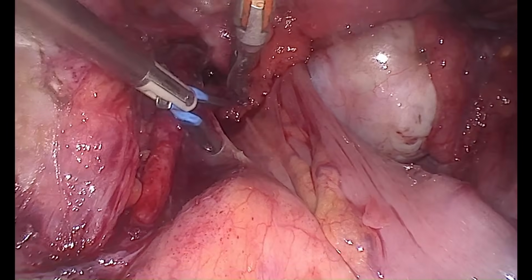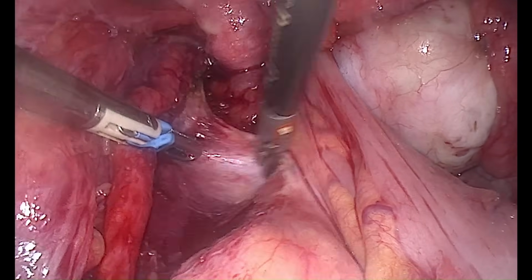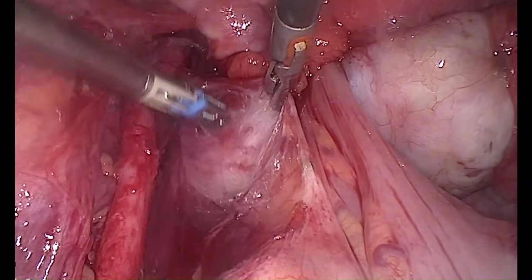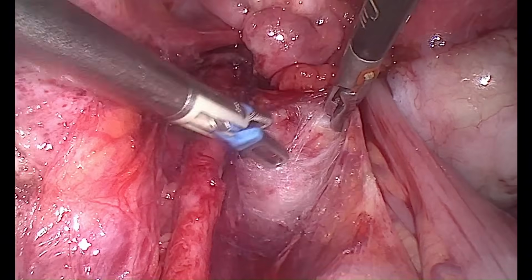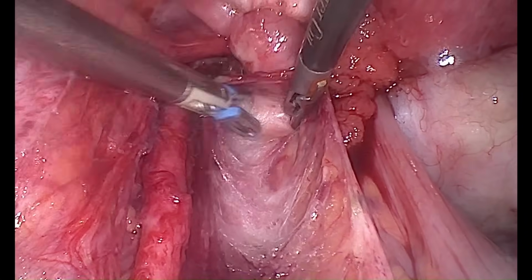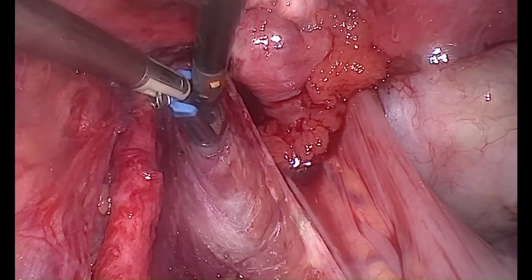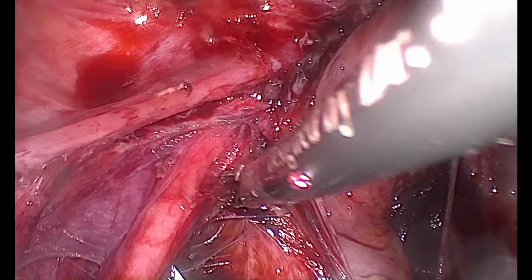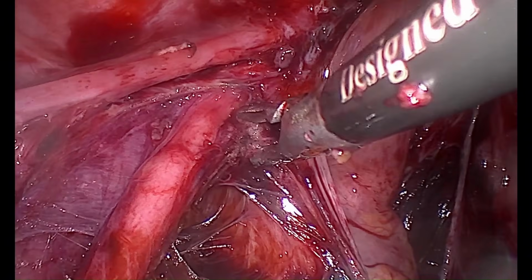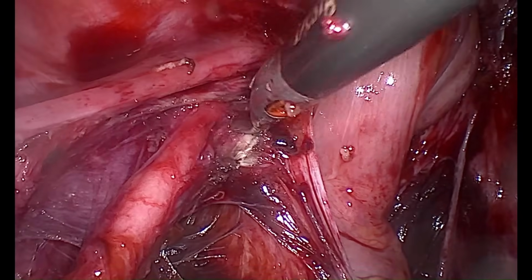You can see another thing, which is called the pararectal space. You need to dissect out the pararectal space. Once the pararectal space is dissected out, the pararectal space dissection again causes mobilization of the ureter from the uterosacral. This uterosacral dissection is helpful when you are doing the pararectal dissection, because the uterosacral is going to become much more evident when you do the pararectal dissection first.